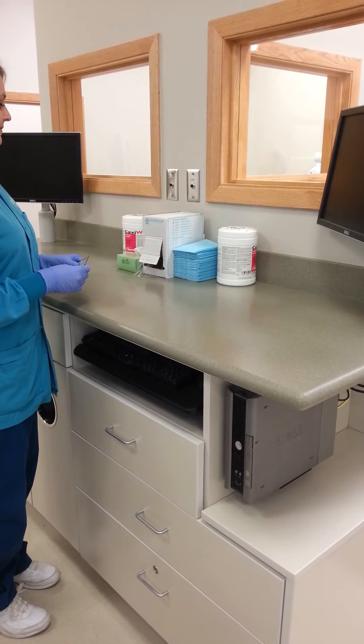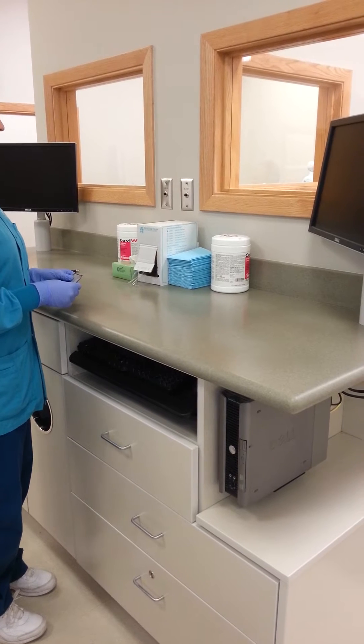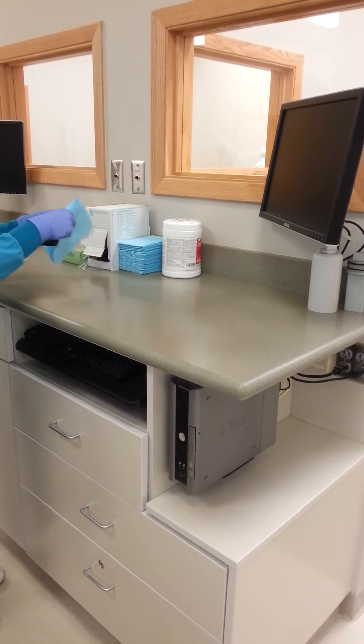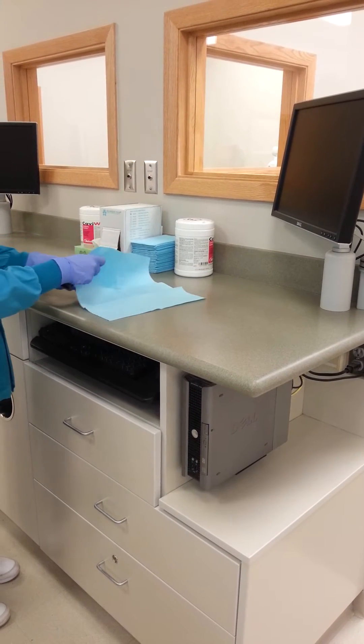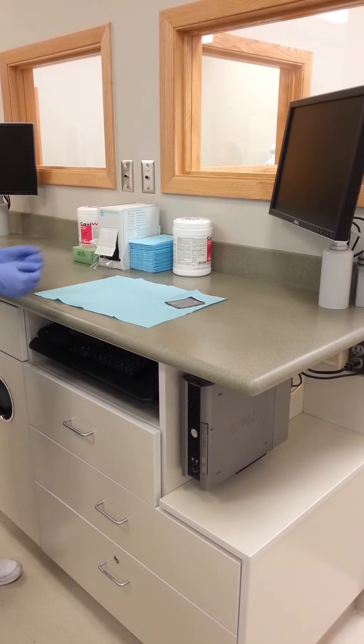This afternoon we will be preparing our station for a mandibular anterior occlusal radiograph. First we need to prepare our operator station by placing the blue sanitary napkin upon the cubicle. Upon this blue napkin we can also lay our size 4 phosphor plate, which we will be needing for the occlusal radiograph.